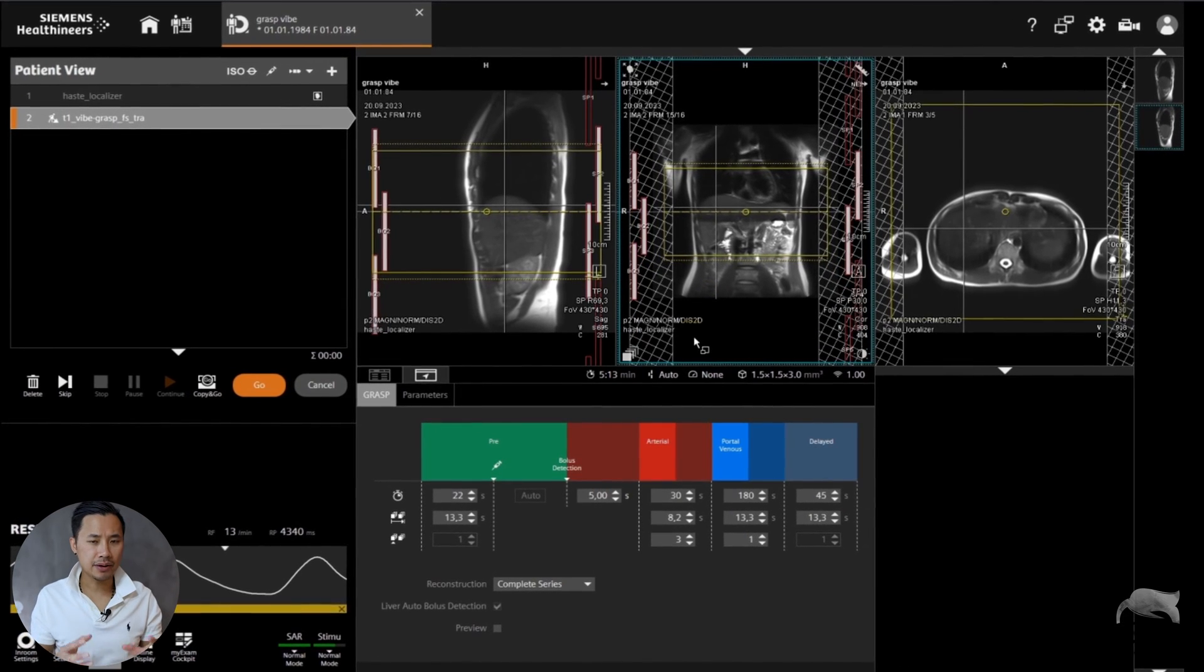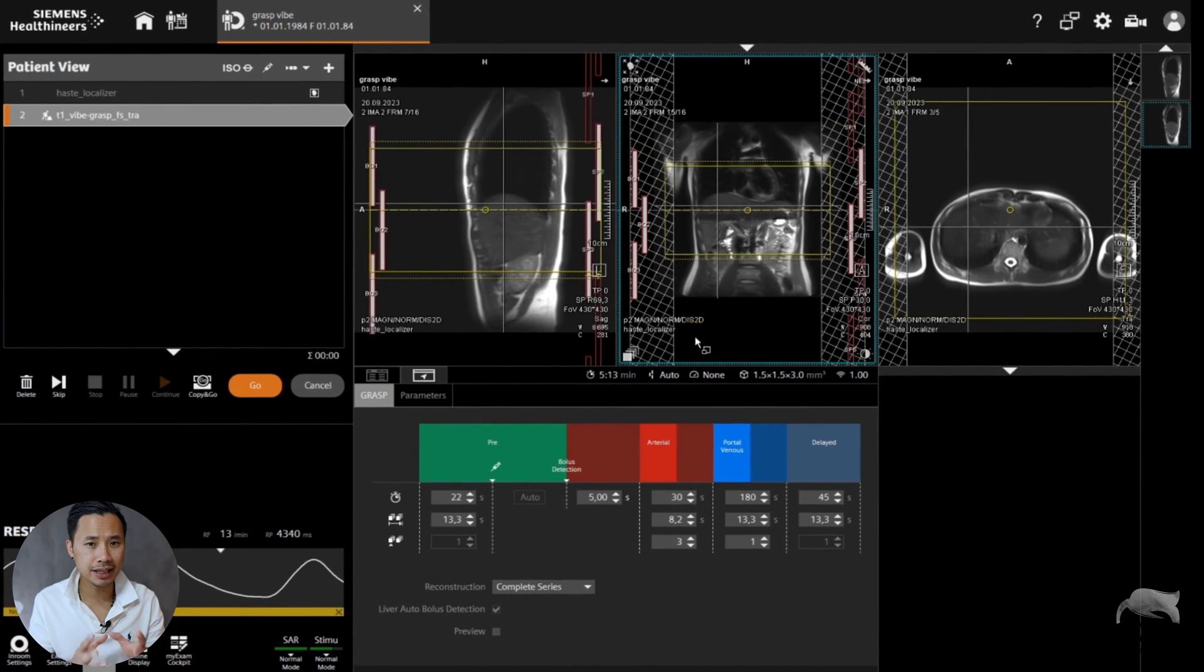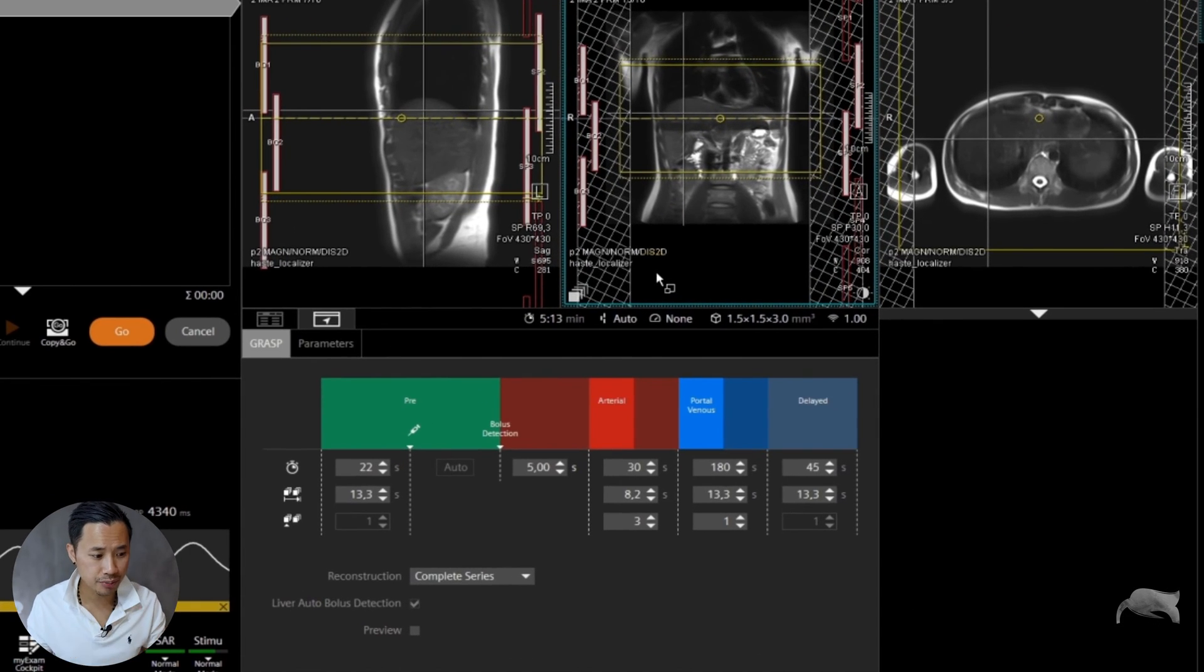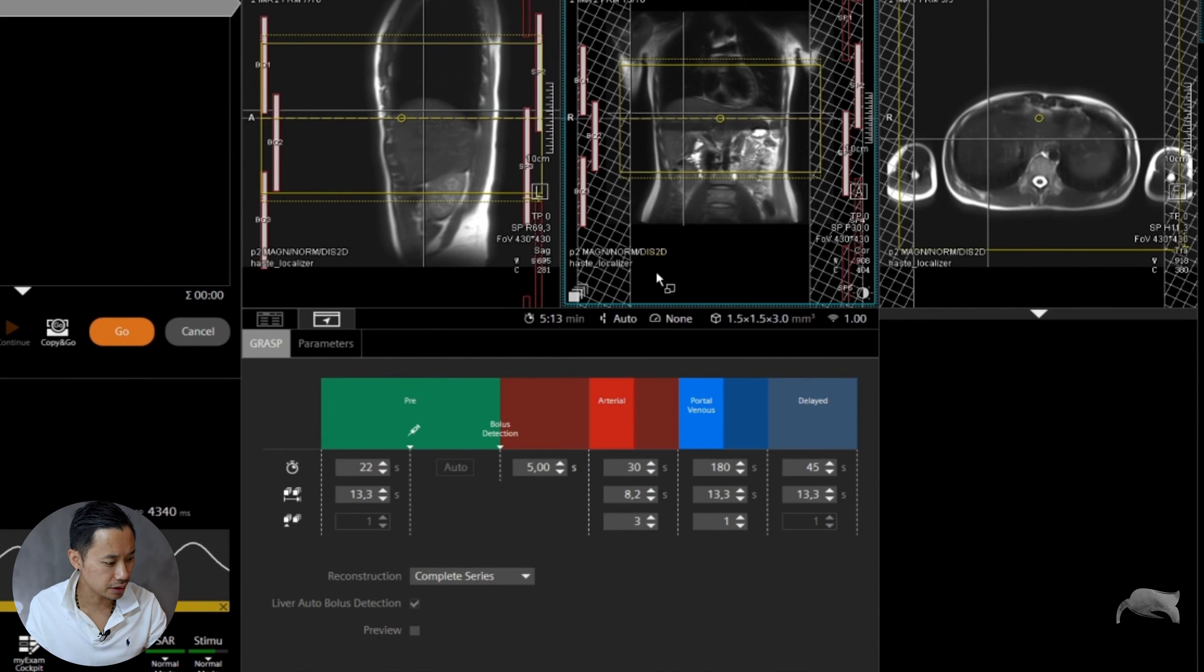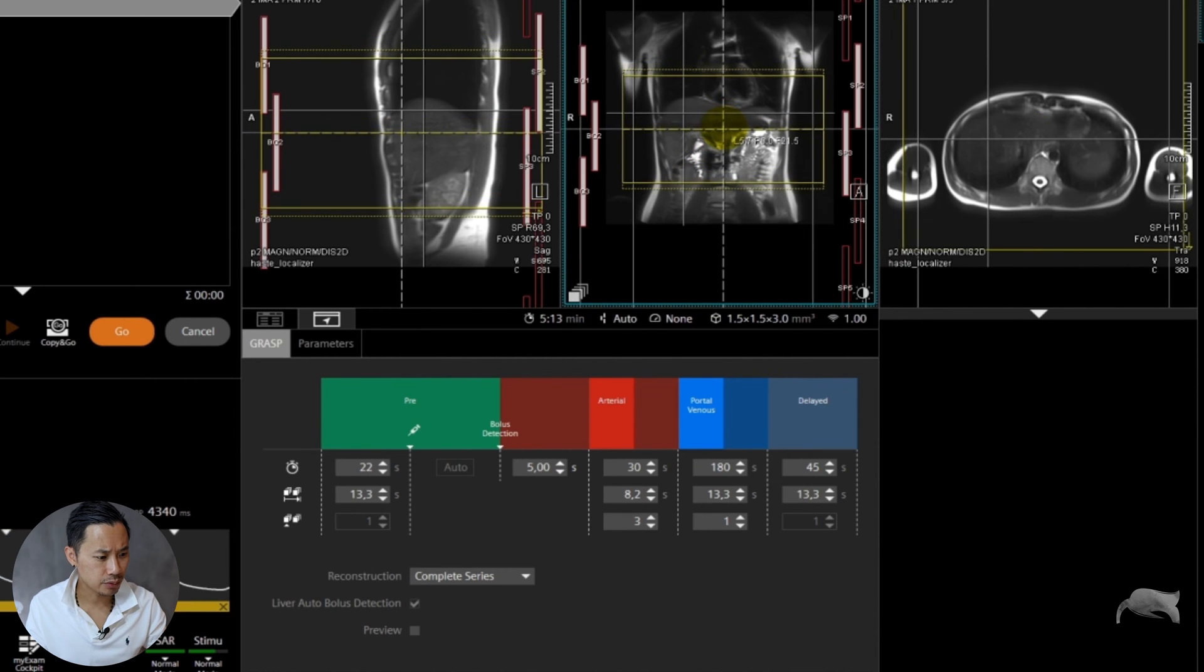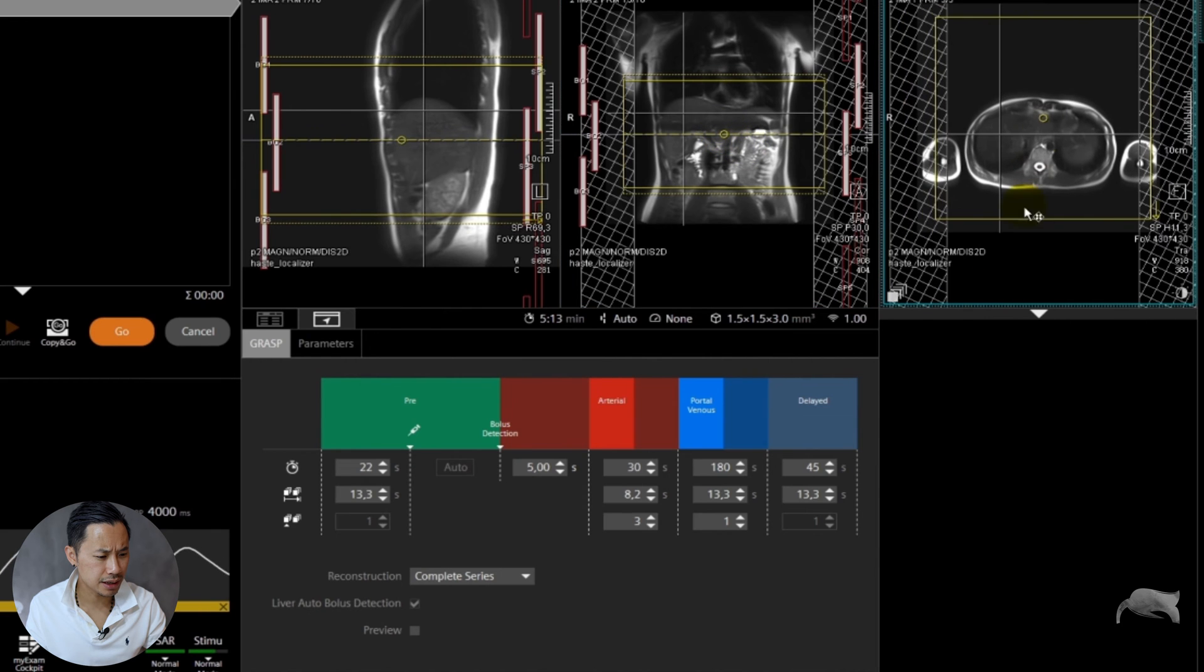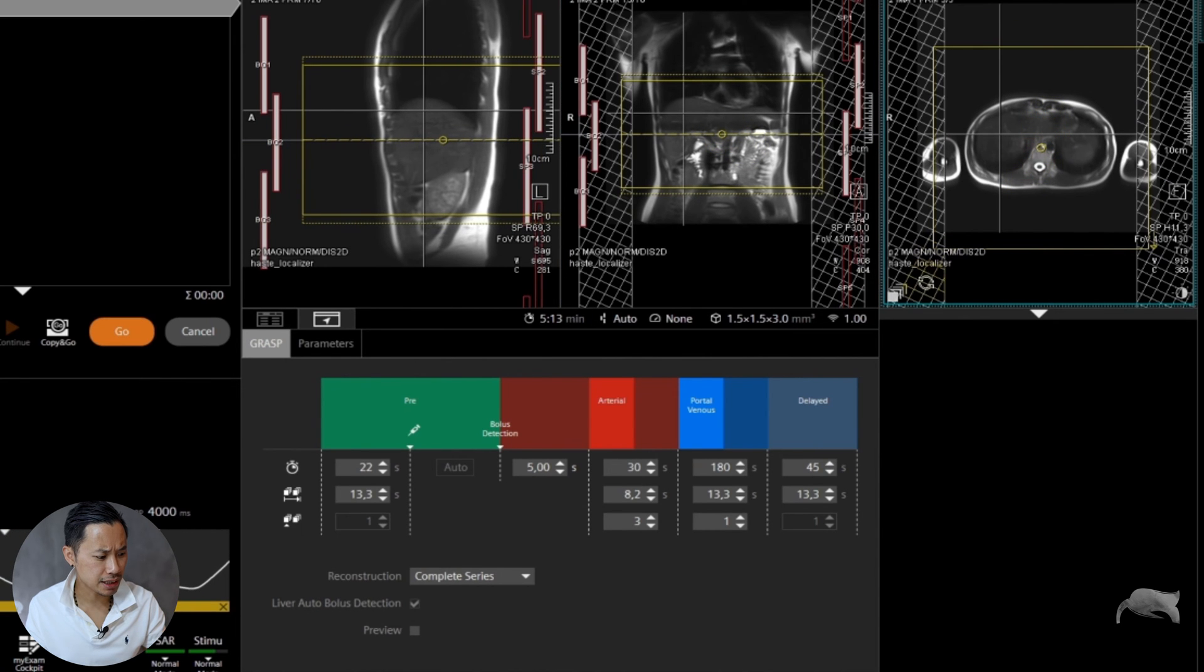The sequence looks like this. Remember this is a free breathing sequence, so you need to use a localizer which is free breathing or you might lose the top or the bottom of the liver. You can see there are sat bands here. The sat bands will help to reduce the streaking artifacts on the pre-images.